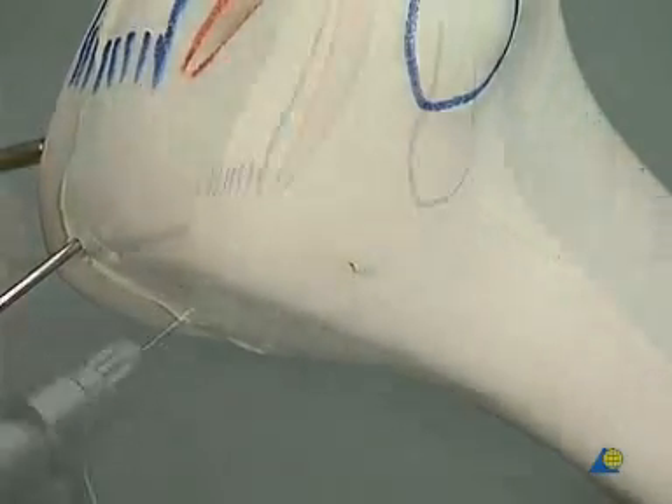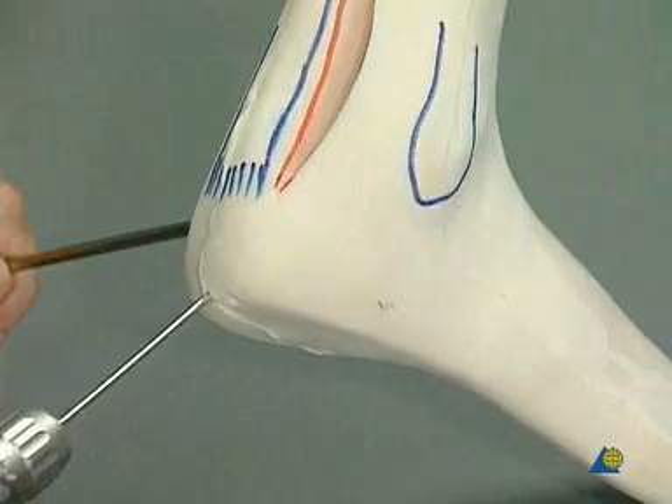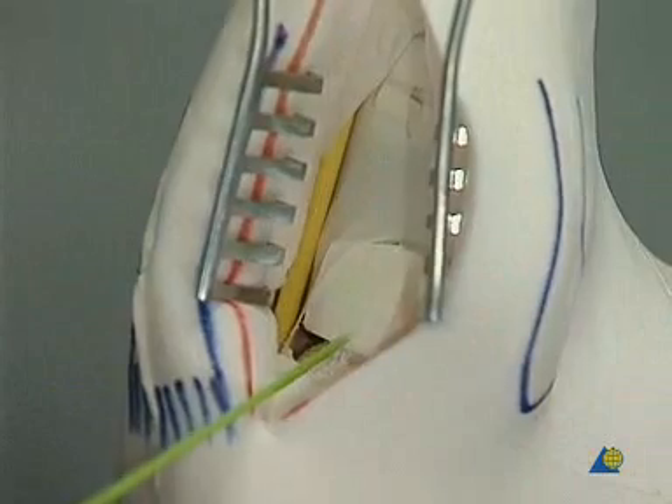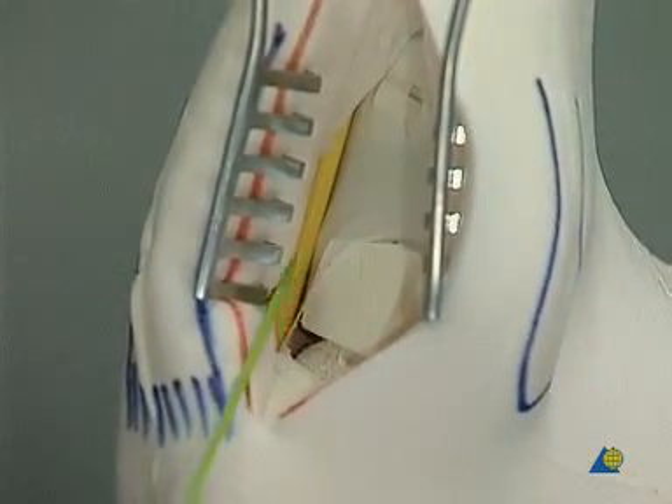The K-wire and the shank screw are removed. The integrity of the neurovascular bundle and the reconstruction is checked.